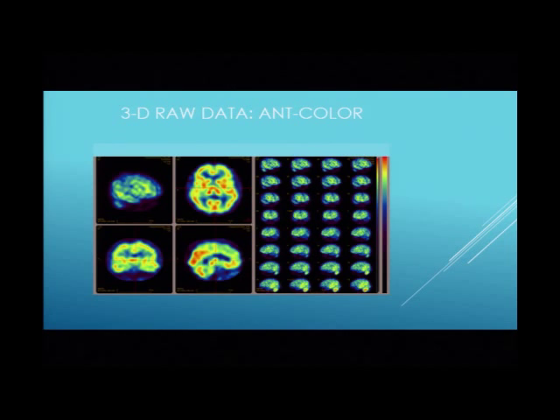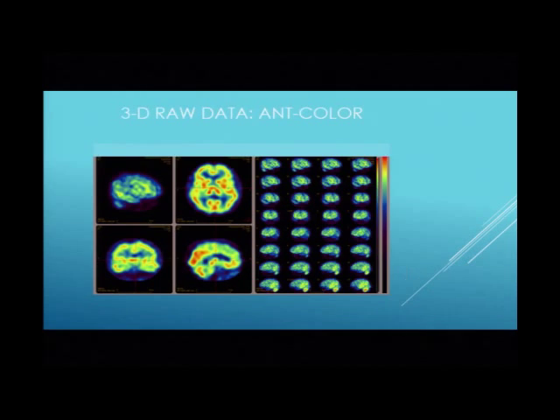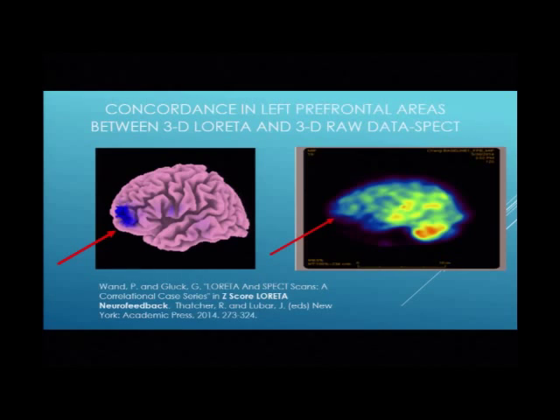And so this is the left side, and you can see that there's a lot of blue here, a lot of blue there, and there's better flow there in the back. And that's the right side, and here's the left side. It's hard to see because of the size, but I'll show you that better in some blow-ups. And this is the back of the brain. See all the colors? Nice and colorful, right? There's your flow scale, just to go back to compare. See how blue it looks in the front? That's the gradient, again, that I was telling you about.